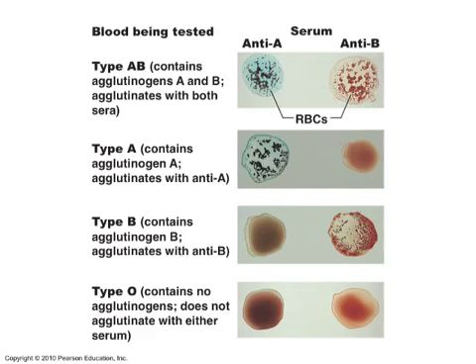Now, those clumps are very bad if they happen within the body, but they do make it really pretty easy to do blood typing. All you have to do is mix an unknown blood sample with known antibodies and see if you get clumping. Okay?